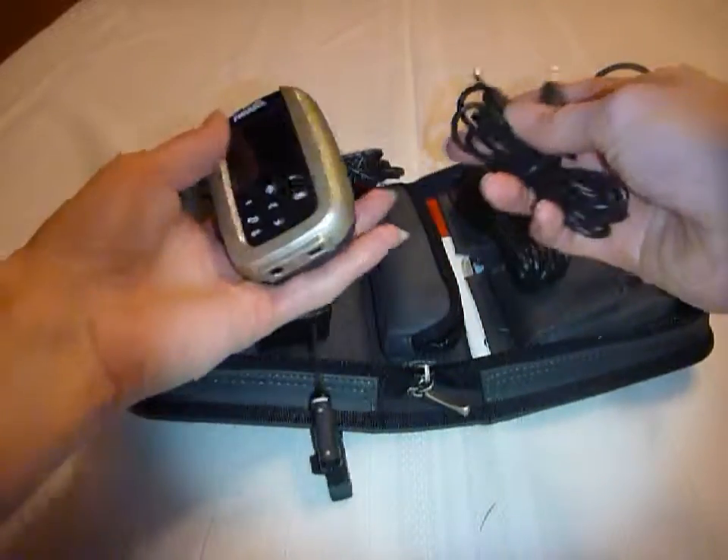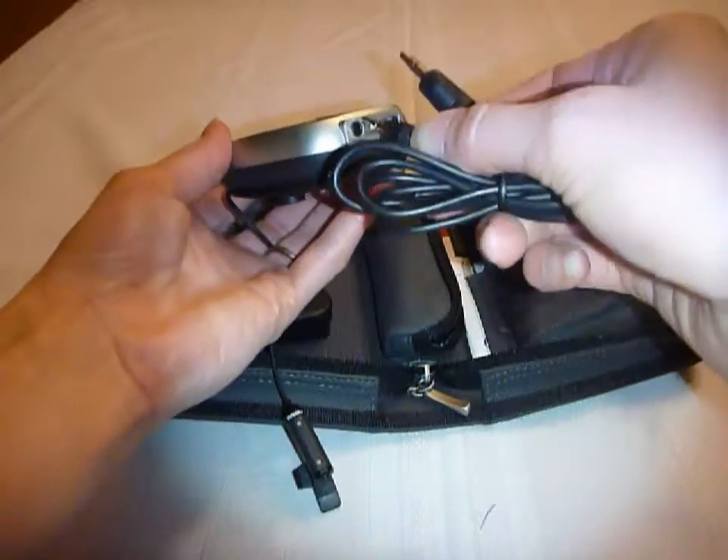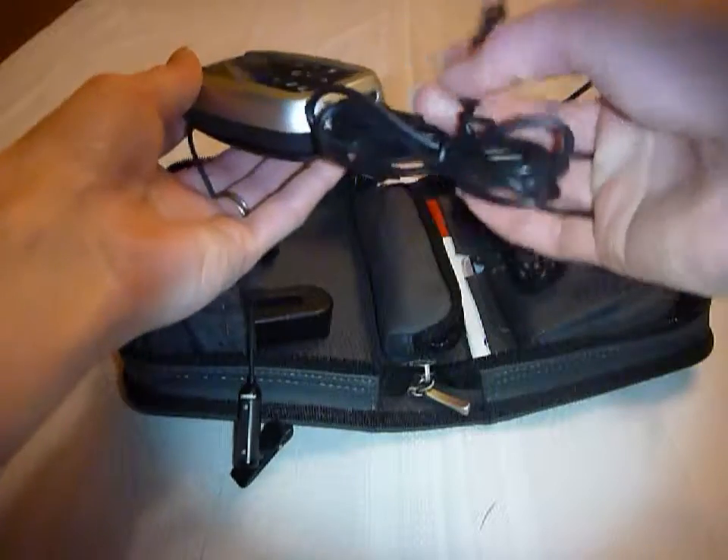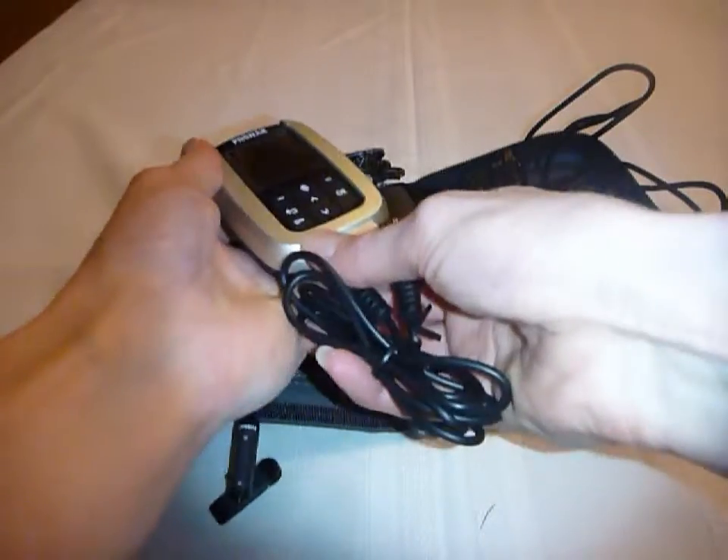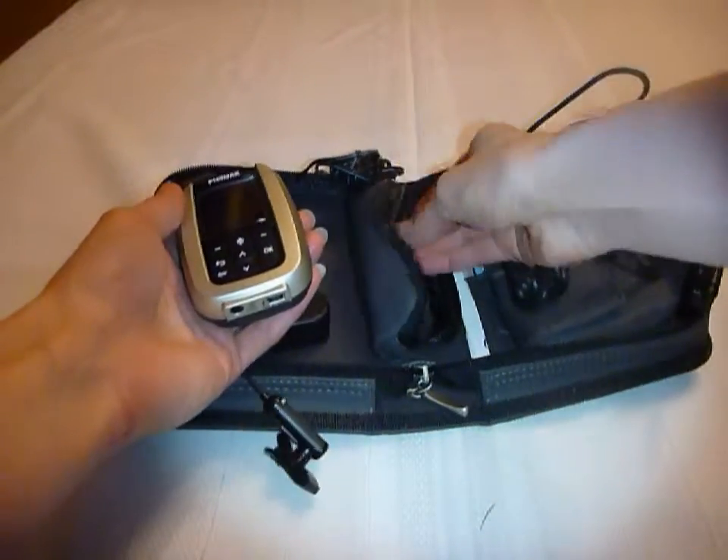The last thing in the middle of the pouch is the patch cord, so that you can hook the transmitter to an audio source such as the computer. And these are the components in your Inspiro kit.